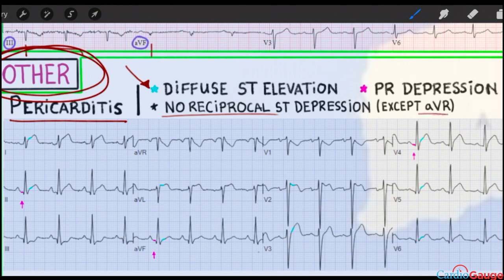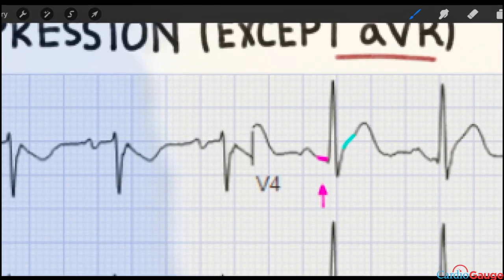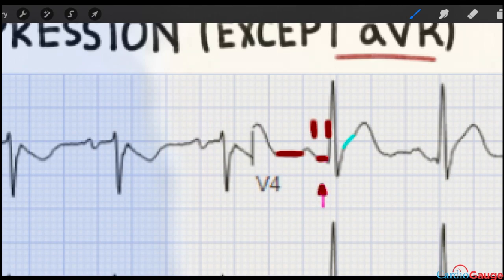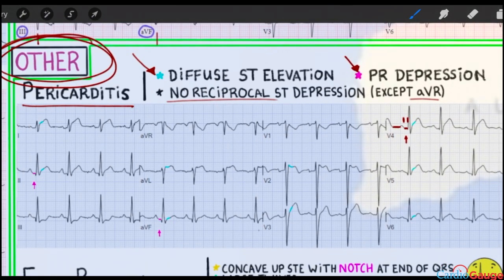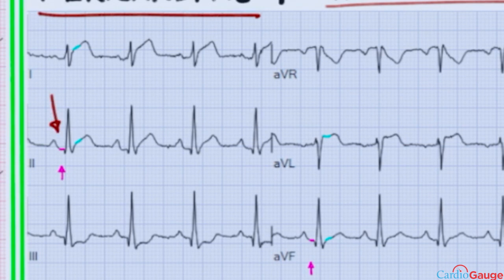except AVR shows ST depression because AVR is in the opposite direction of basically all the other leads. Another thing you can look for is PR depression. The PR segment goes from the end of the P wave to the start of the QRS. And you can see that in this lead it's decreased compared to baseline. That's PR depression, and in this example you can see some PR depression in lead two and F as well.